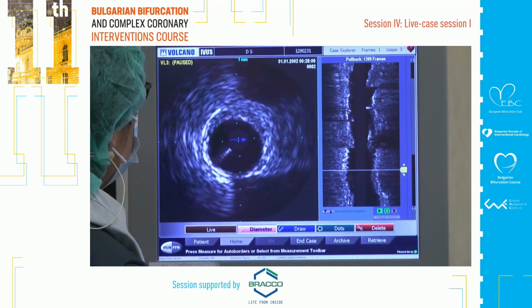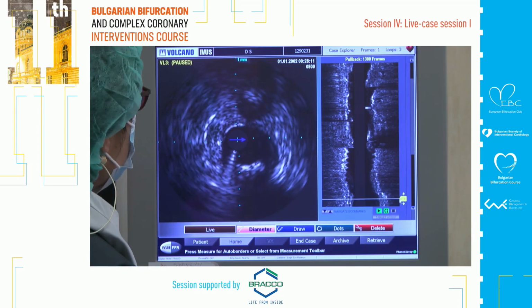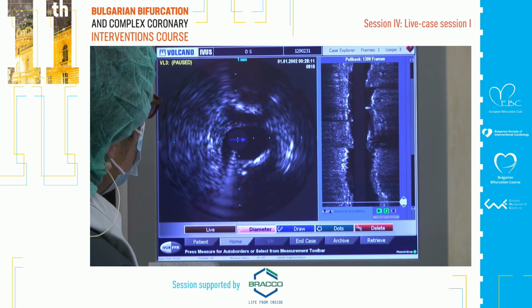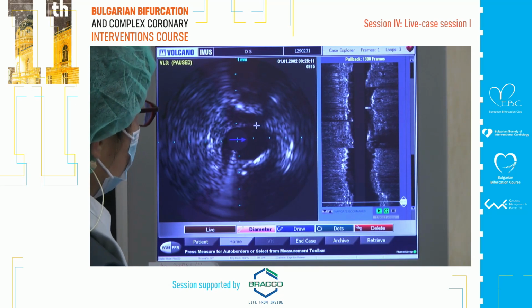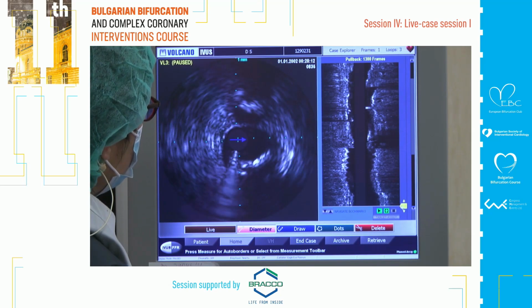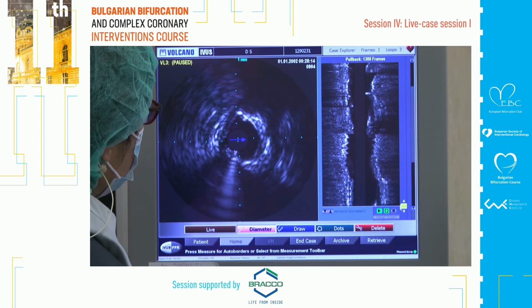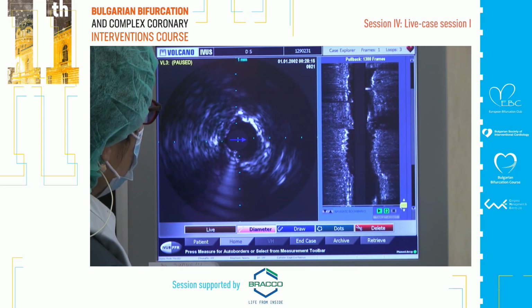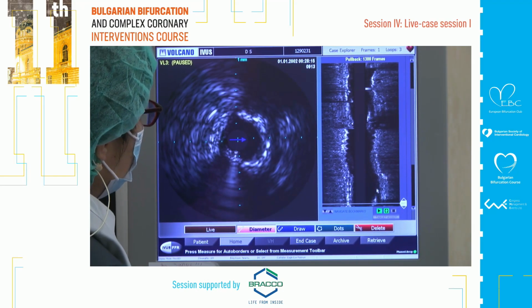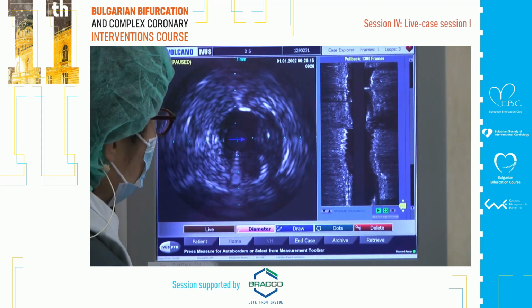Okay, go more proximally. There is soft plaque there. Still this is okay. Okay, so this is exactly the region. This is a septal, which actually has a calcified ostium, interestingly. This is a LAD and also calcium, but not too bad. And then come back. This is the exact region, but still the calcium is only 180 degrees from here to here. And then more proximally, interestingly, this portion was actually soft plaque.